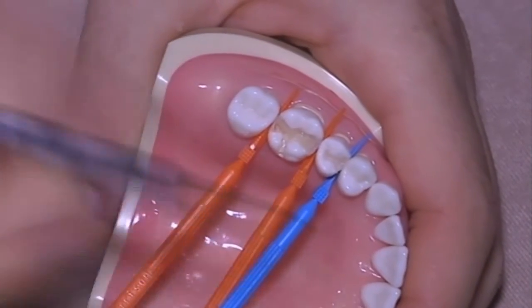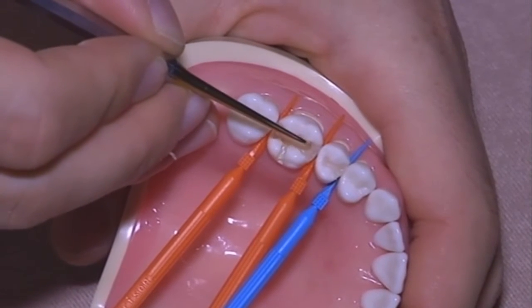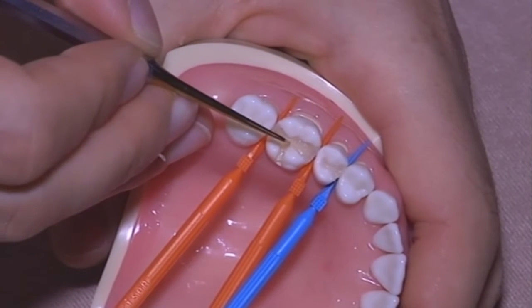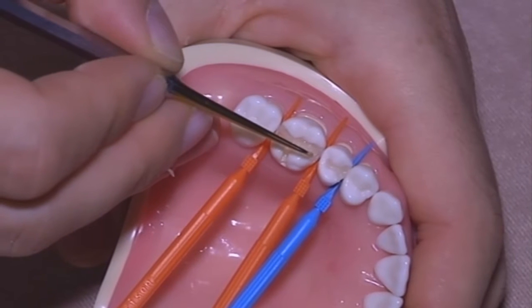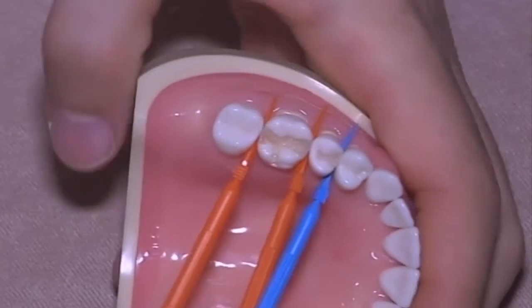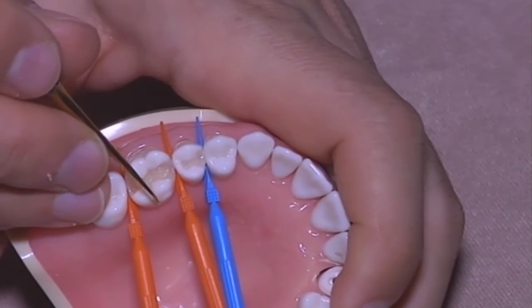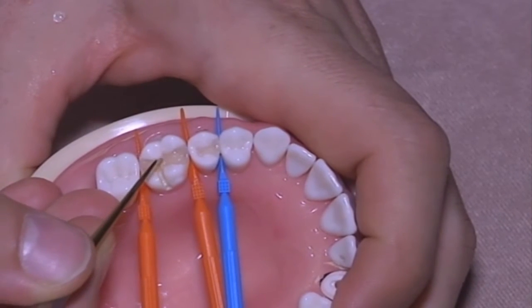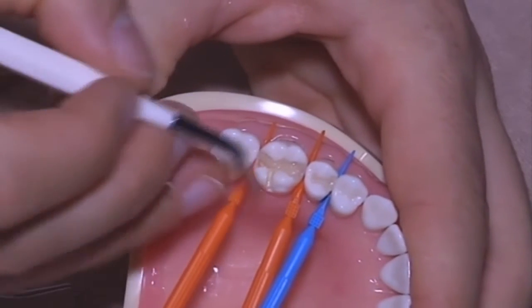It's always the same procedure. Here we have a little bit too much dentin. And thus you can move it. And then you come back again with the brush.